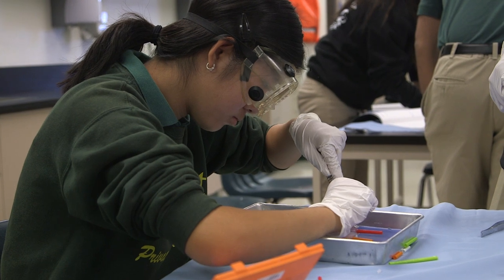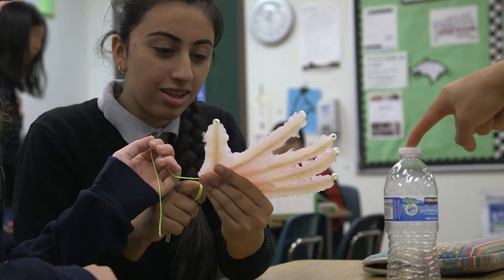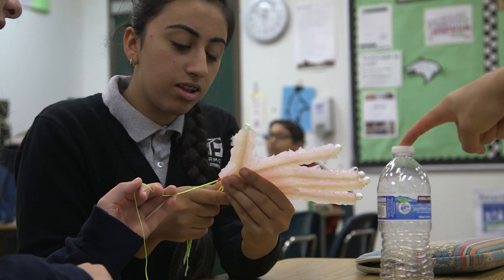We fixed the joints to make sure that when you pulled on the string it curled in like a regular hand. Once that was figured out and all those were applied to the hand, we had a working silicone hand.